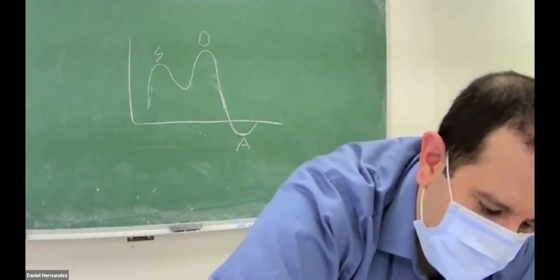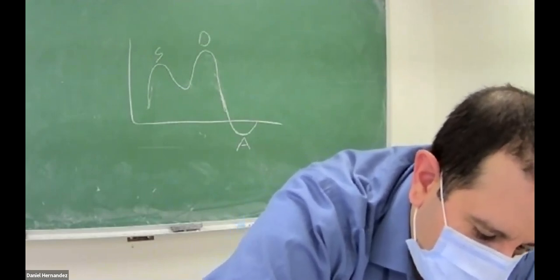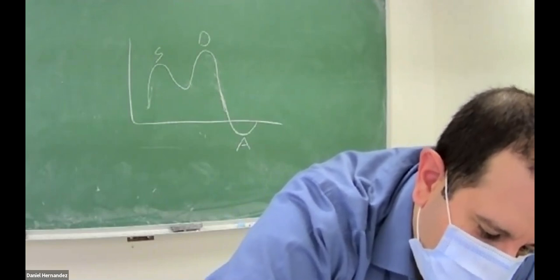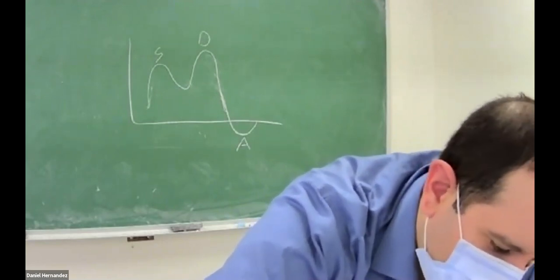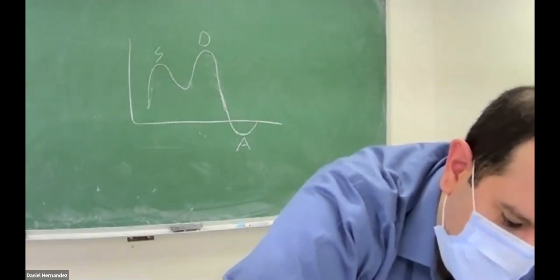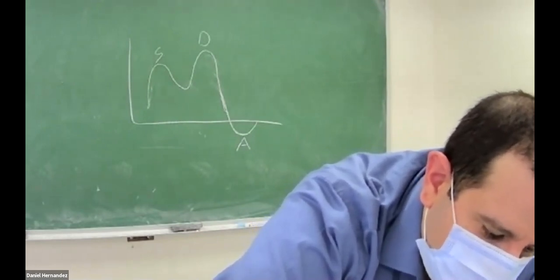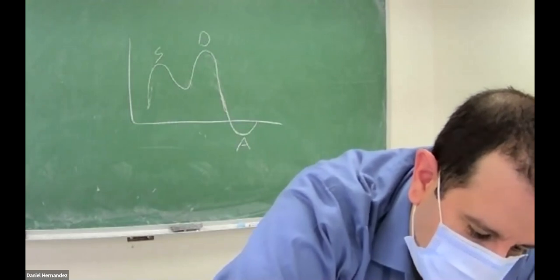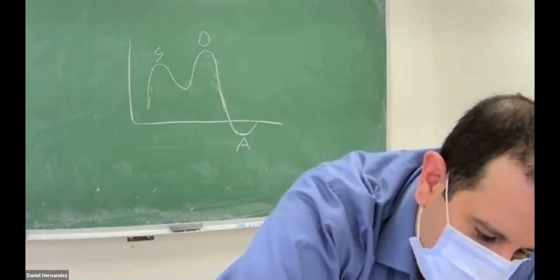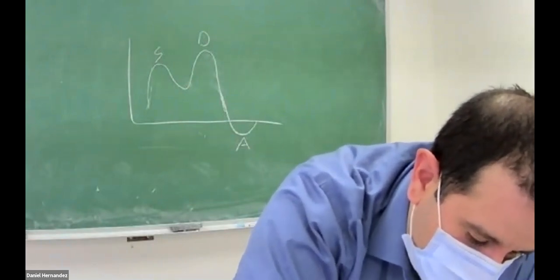So which of the following best describes a pseudoaneurysm? That would be a contained ventricular rupture. Again, the options were a hole between two ventricles due to ischemia, a hyperdynamic left ventricular wall with an exaggerated systolic contour, or a dyskinetic region with abnormal diastolic contour. The first one? Yep, the contained ventricular rupture.